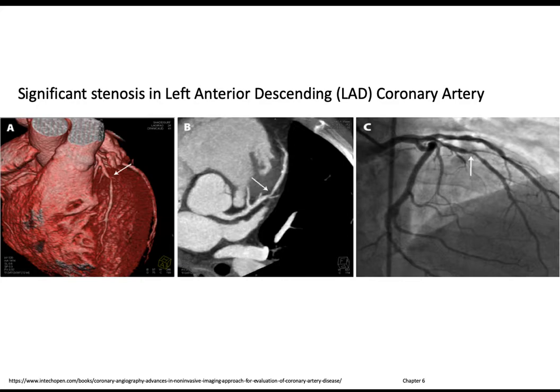Yeah, kind of. And that's a part of it, but it means that it's a slice. Right? It's like a prosciutto slice or a deli slice. A projection image is some summation. So the one on the right, what you want to be careful of is that it's a projection image. You're shooting a 2D X-ray, kind of like when you see your chest X-ray, through your vessels. And so things can pile up in ways that maybe mask or hide the true dimensions of certain things. When you get a chest X-ray, you can't really tell if your heart is in front of your ribs or behind it or inside of it, because they're all added together. But in a CT slice, you can tell, right? So like here, you can tell spatially this vessel is in front of that one, etc.